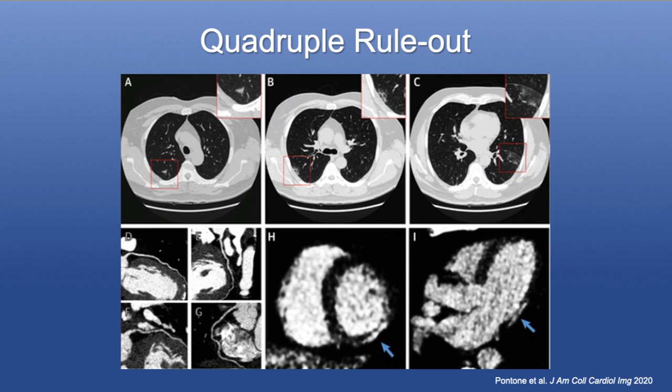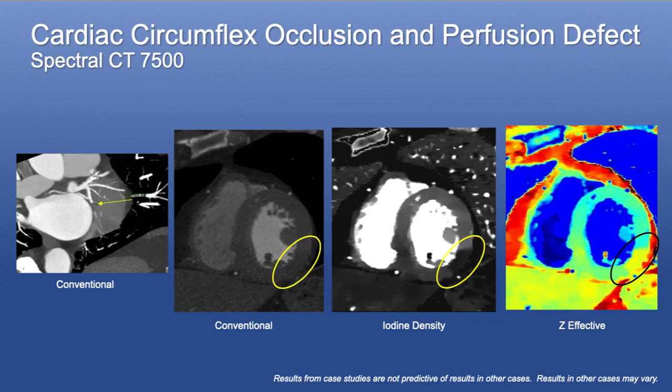The images can be a little bit noisy, but as you can see here in this case, you can see it clearly in some cases, and I'll show some more images about this. Dual energy will also help us to identify, sometimes when we're doing a case like we can see on the left, that potentially there could be an obstructive artery, but we don't know if this is an artifact, a complete total occlusion, or if we're just overcalling in the presence of a highly calcified lesion.